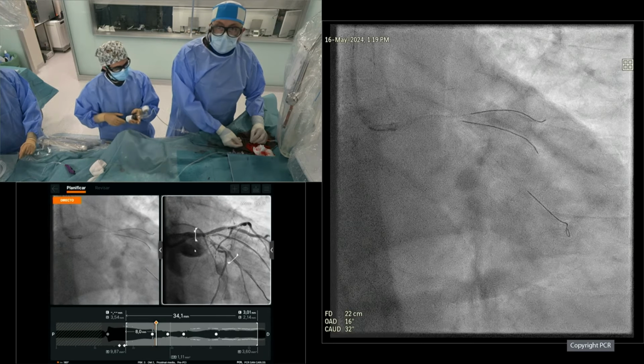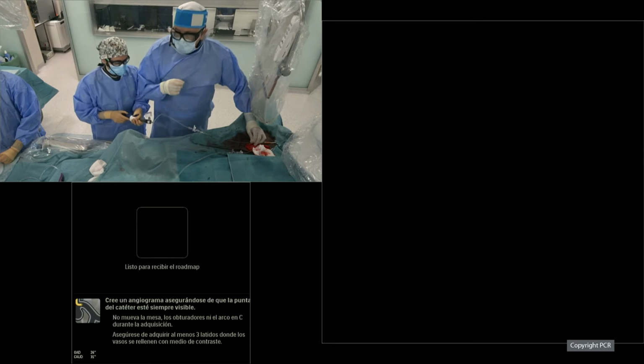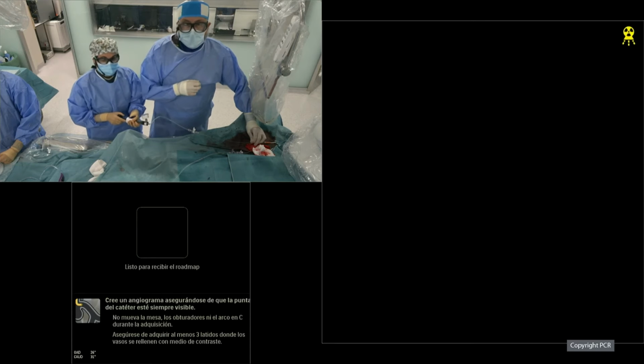We don't need really to go high pressure here, because the thing is only opposing the stent to the left main. Pass me another wire, please. Is this a semi-compliant or non-compliant? It's an NC Trek balloon. NC. So we are bringing a fourth wire, the next step is rewiring the LAD.